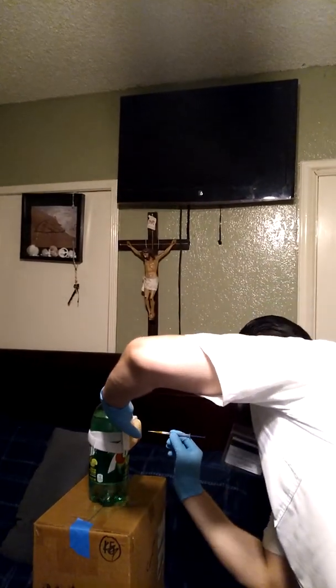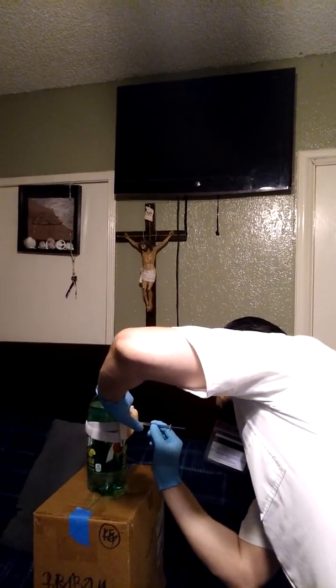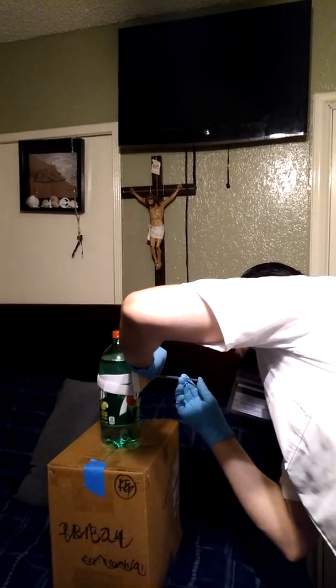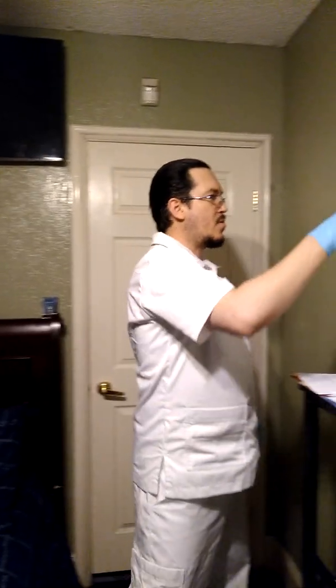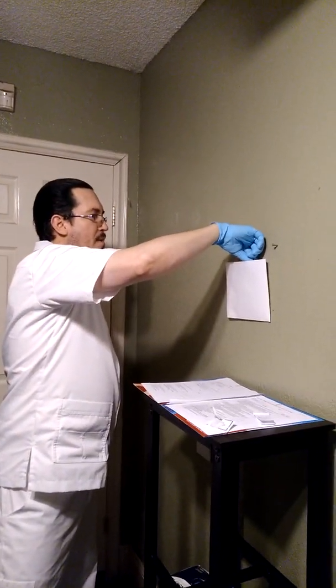Okay, here it goes. Thank you so much. We'll get the syringe and dispose of it without capping it. Next, let me change my gloves. These gloves are wet. The angle of the needle was at 90 degrees, and it's an intramuscular injection.